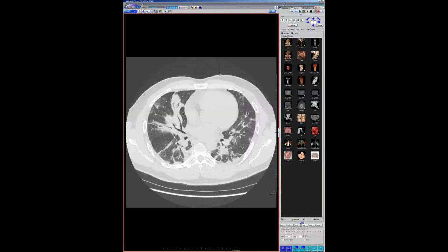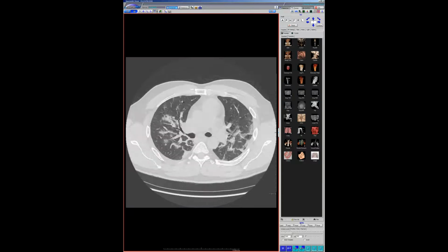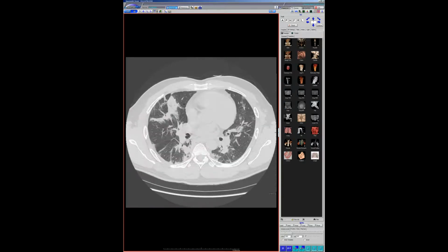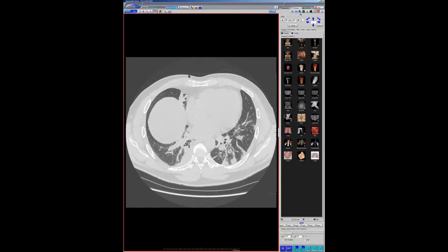But anyways, our first case here, the question is, we have the imaging patterns, and I'd be curious to hear what you guys are saying, because we're dealing with this right now. We have imaging patterns that are classic, and then we have imaging patterns that aren't classic. For the imaging patterns that are not classic, what are you telling your clinicians, or what are you putting in your official reports? Because we don't want every dictation to say, can't exclude COVID. But when you have indeterminate patterns like this, this could be organizing pneumonia from anything. It's really not the most classic appearance. Do you say multifocal pneumonia and just leave it at that and let them figure it out? What are you guys doing?